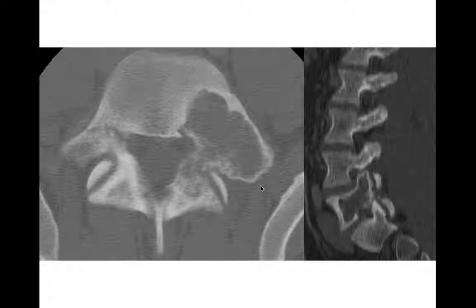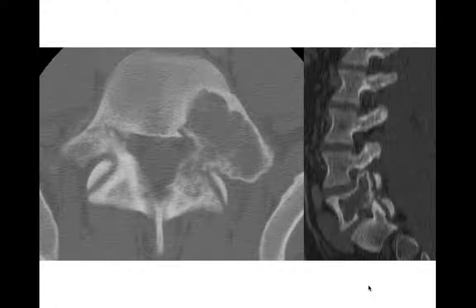Here's another aneurysmal bone cyst of the lumbar spine — a geographic lytic lesion extending into the posterior elements, involving the vertebral body and posterior elements. ABC and giant cell tumor can occur in the spine, so both are good thoughts here. Osteoblastoma would be another consideration — we don't see matrix, but it's still possible. In an older adult, mets and multiple myeloma should be at the forefront. This was a younger patient with a benign aneurysmal bone cyst.